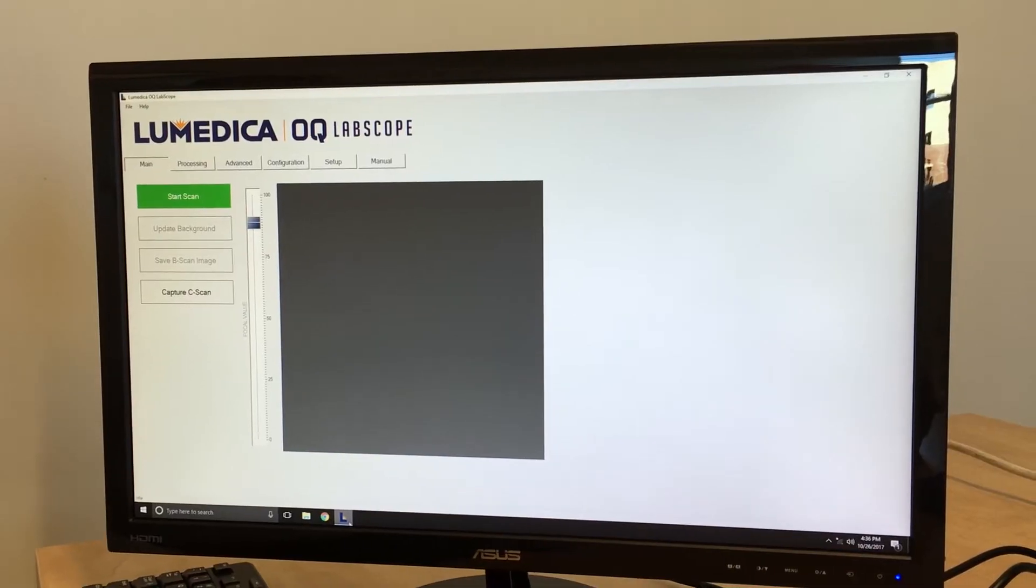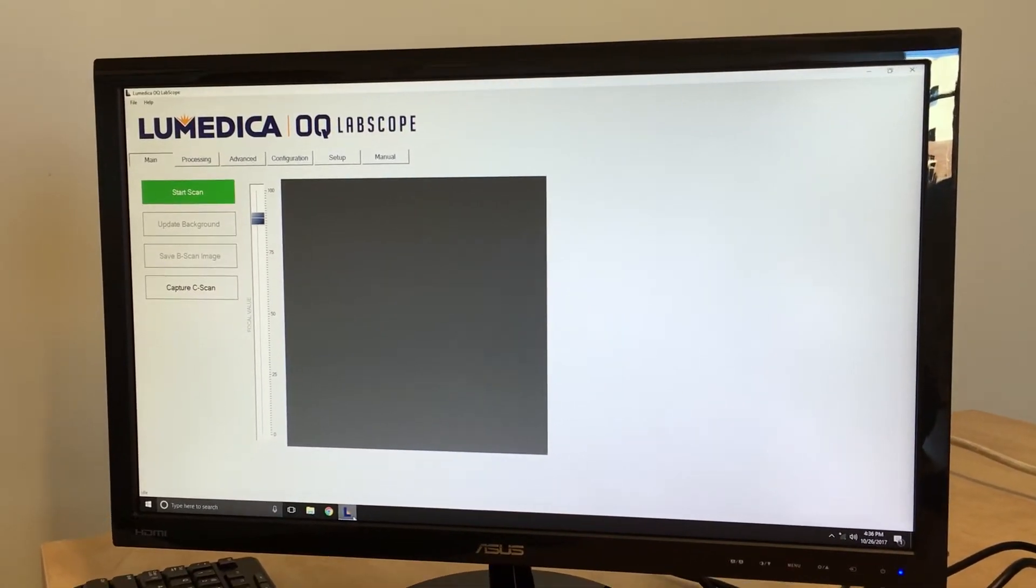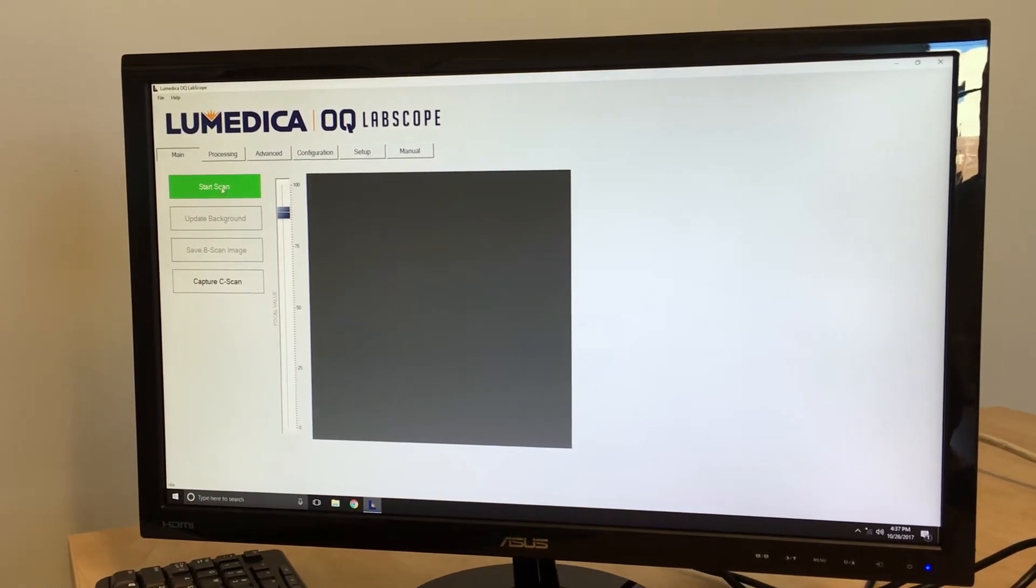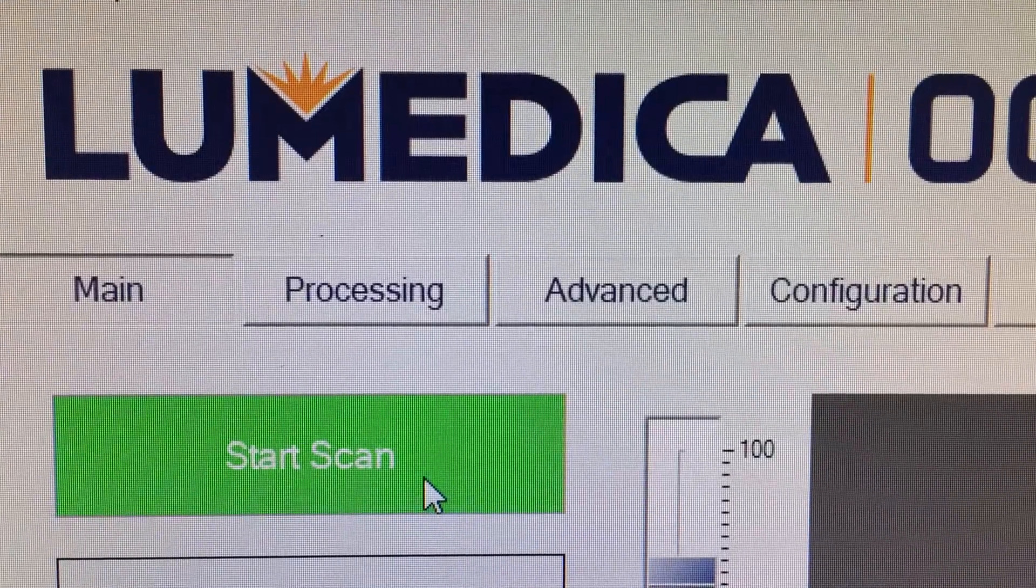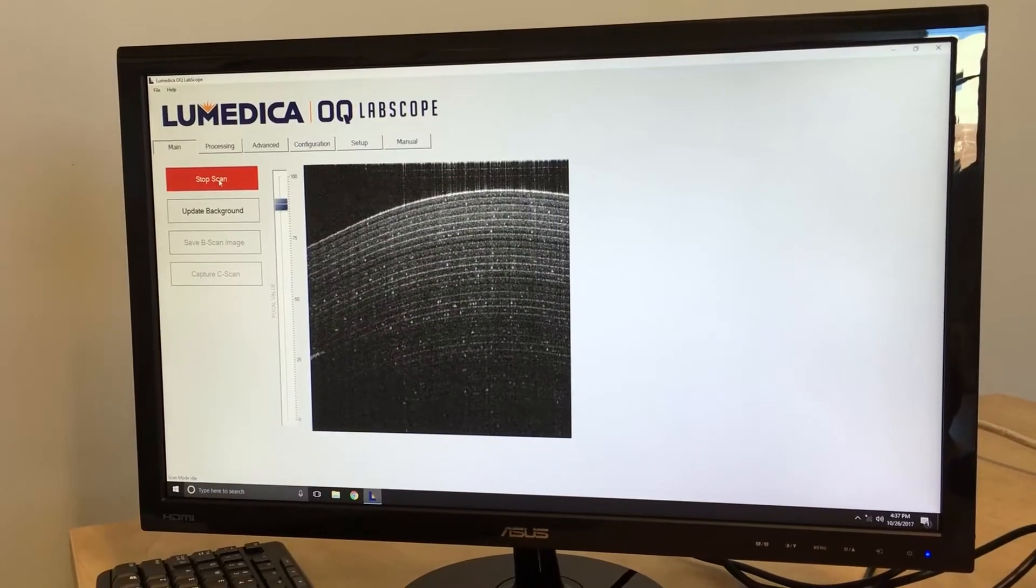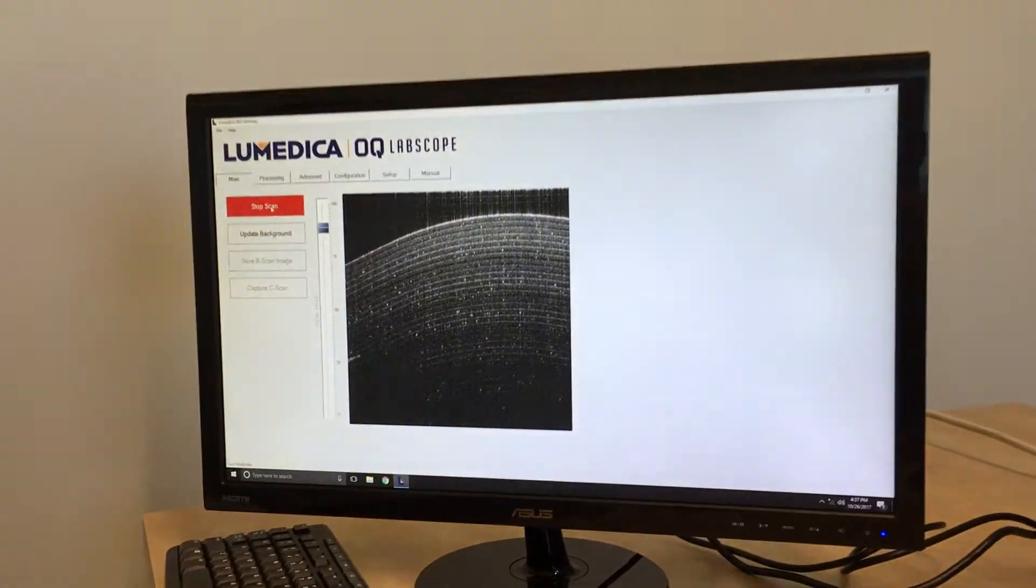Here is the startup screen for the Labscope software. To initiate a scan, you simply click on the Start Scan button. And the image appears right here, in less than a second.